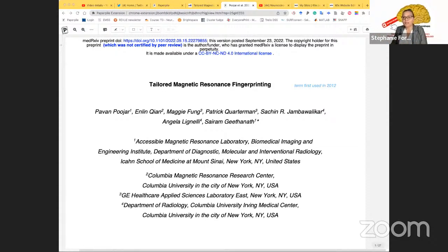And why do we need it? We need it because right now, quantitative MRI has quite a long scanning time, which then often leads to discomfort in patients, especially when you're scanning geriatric or developmental pediatric patients, but also in acute stroke, for example, where time is brain. We don't really have the luxury of acquiring images over a long period of time.